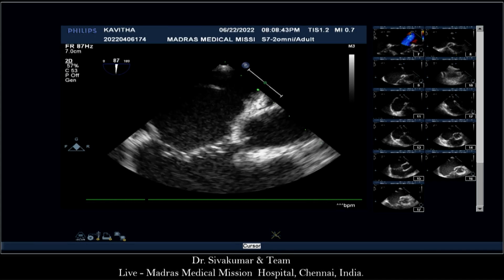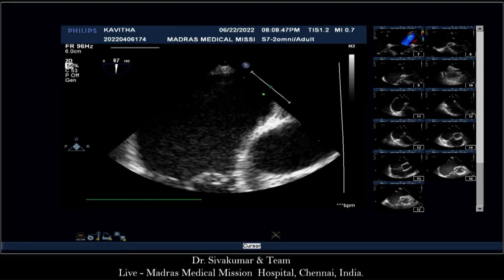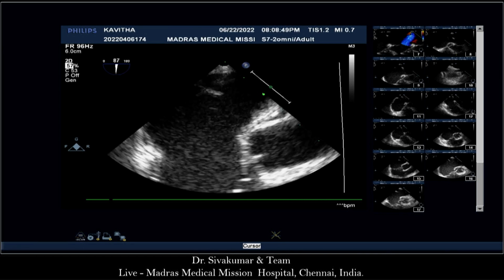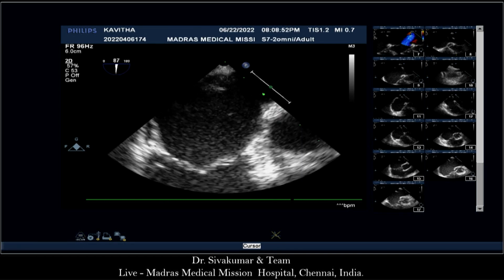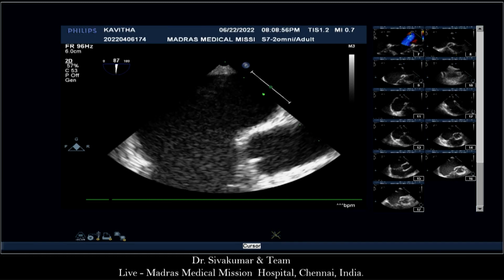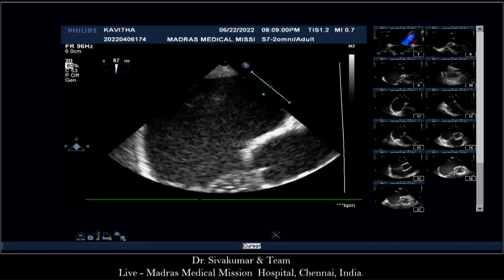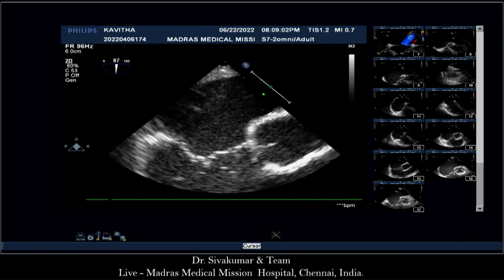So next question for the audience, hands up: is it malaligned or not malaligned? Is it malaligned? Is it not malaligned? There is some malalignment. Okay, we all think it's not malaligned, sorry about that. But Bharat's with you.